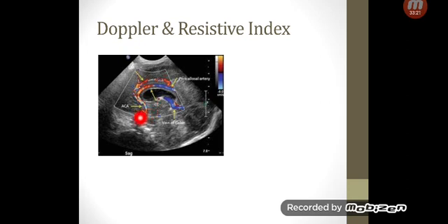You will see the anterior cerebral artery here. You're going to see the artery and the vein connection around the corpus callosum, going to the pericallosal artery, and then the vein of Galen is coming from here. So again, anterior cerebral artery, pericallosal artery, vein of Galen.